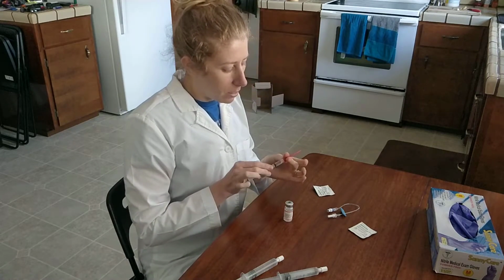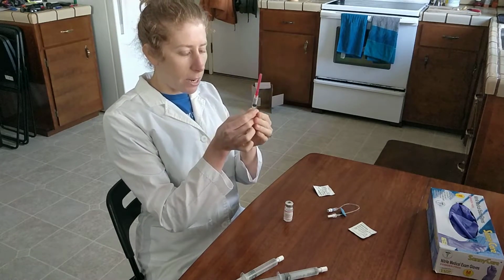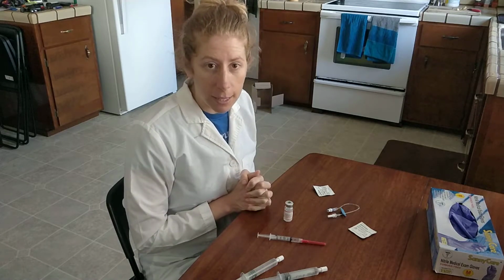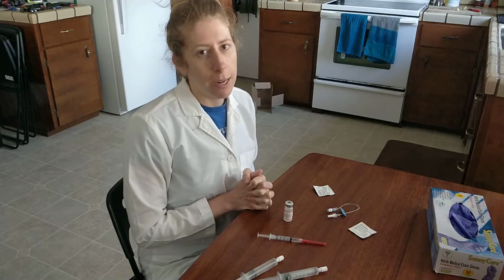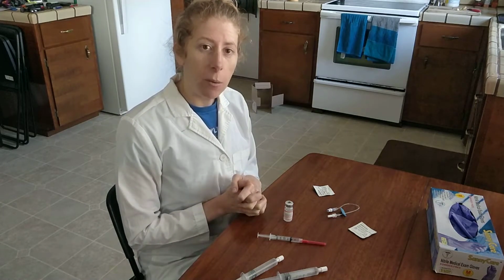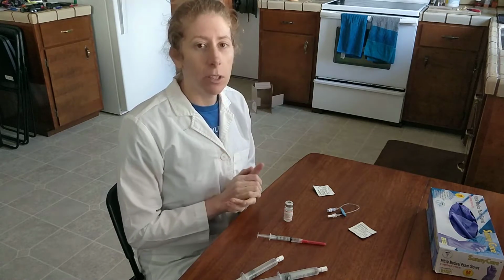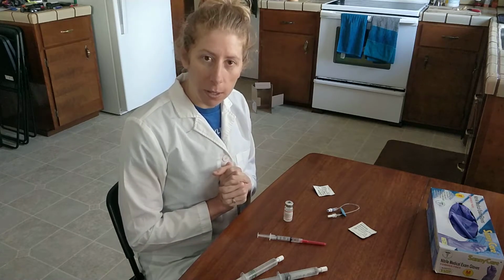I will recap the needle for sterility. Again, reconfirm that I have the correct medication amount. Then I will check the patient's vitals as indicated. And after that, I will perform the 3rd check of safe medication administration. I will explain to the patient the medication I'll be giving them, tell them why I'm giving it, explain any adverse reactions that they should notify me of, and allow them the right to refuse.